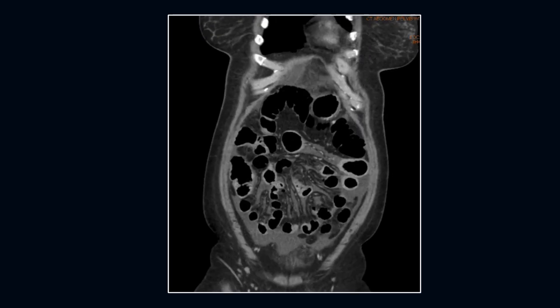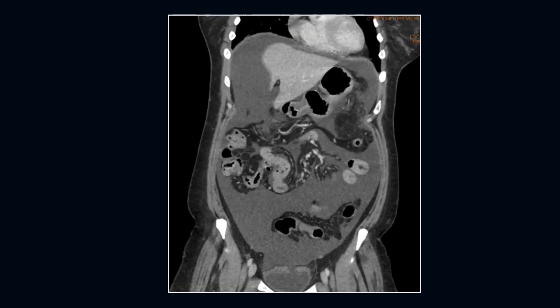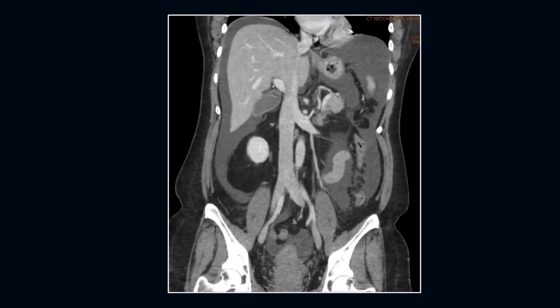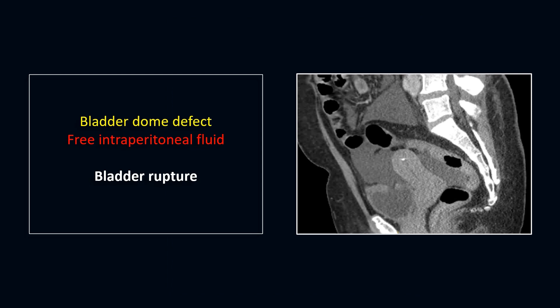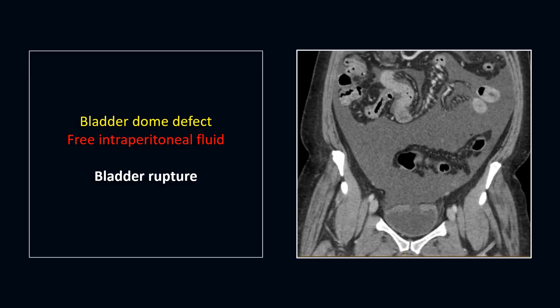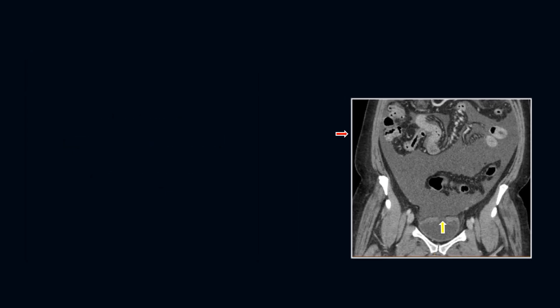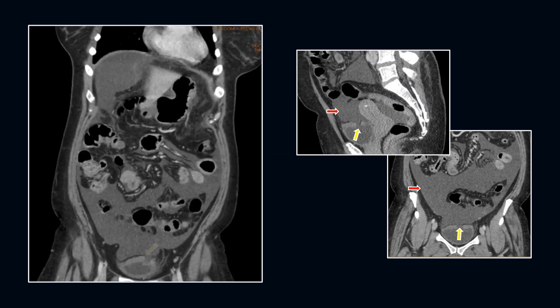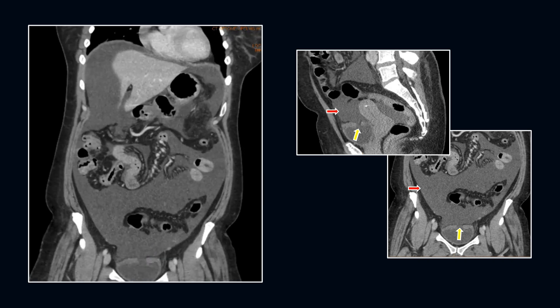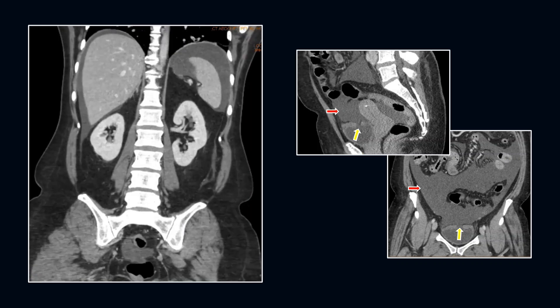Next case, here we see a lot of free fluid in the abdomen and pelvis. We can now see the source of the fluid — there's a large defect in the dome of the urinary bladder with free fluid around the bladder and the uterus. On coronal images, we see the defect in the bladder dome and lots of free fluid in the abdomen and pelvis. Note that the free fluid is seen around the bowel loops. There is rupture of the bladder dome.